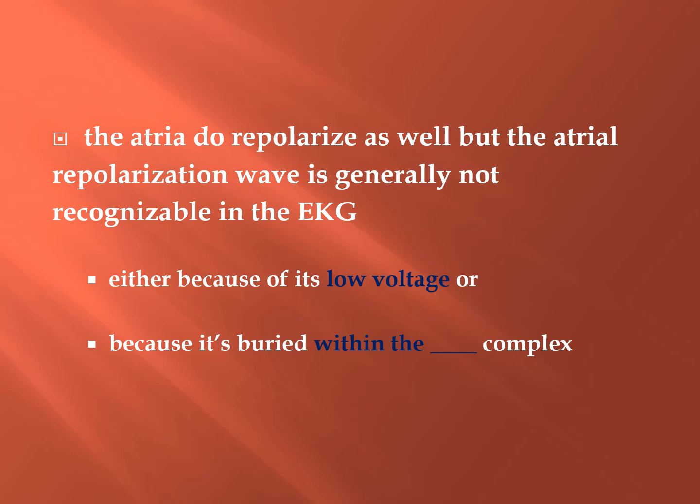Because of the low voltage, or because it's buried in the QRS complex, you will not see the repolarization of the atria, but you will hopefully see a repolarization of the ventricles.